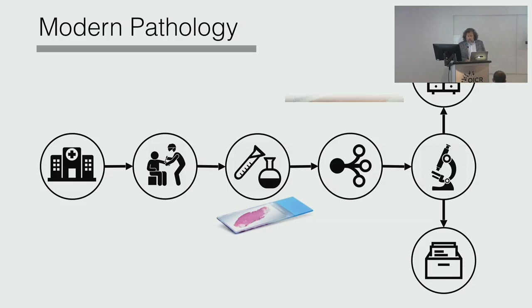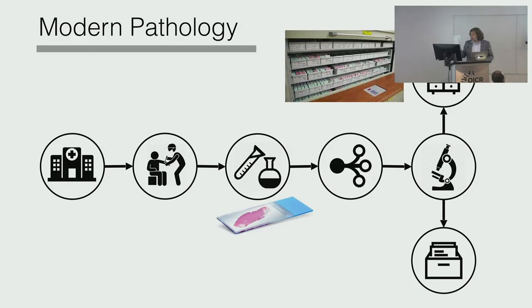And that piece of glass slide will go and get archived. Different countries have different rules, but basically we have to keep them for many, many years. The patient may come back, we have the block, we can make another cut and take a look at it. Also, not just for the patient record, but probably for research. Although, to my knowledge, when the glass slides go to those large archives in the basement of the hospitals, usually they are not touched anymore. So they stay there, and most of the time nobody does anything with them.